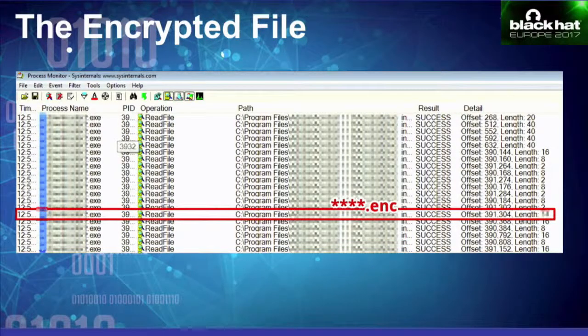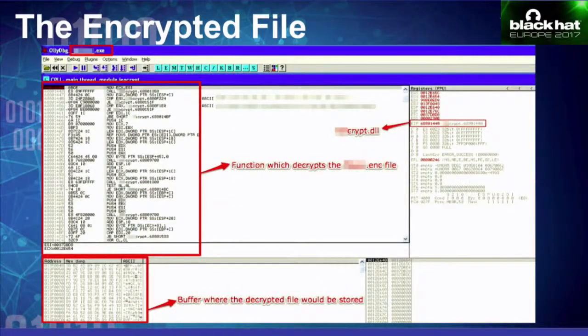So, like I said, I treat myself as a wannabe reverse engineer, so we started to reverse engineer the application. I put OllyDbg in there. It's a system-level debugger. I used OllyDbg because it doesn't require any installation. It's just a standalone binary. So we loaded the digital pen application in there and started doing some dynamic and static reverse engineering.